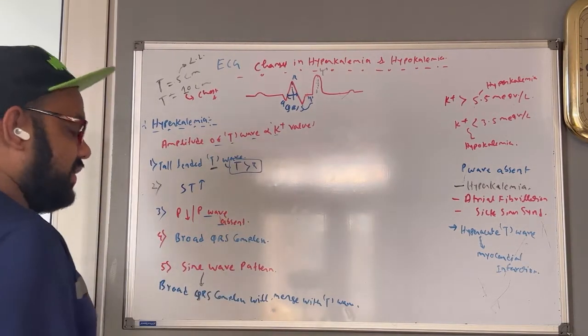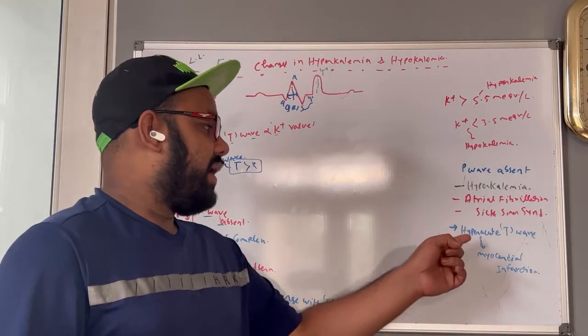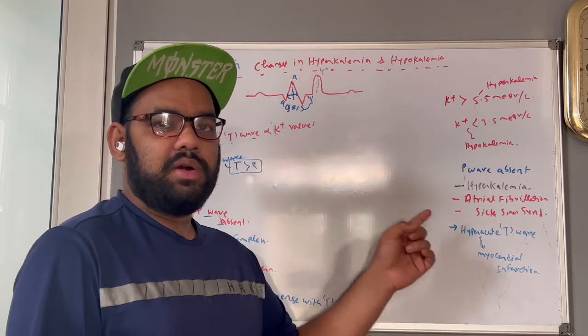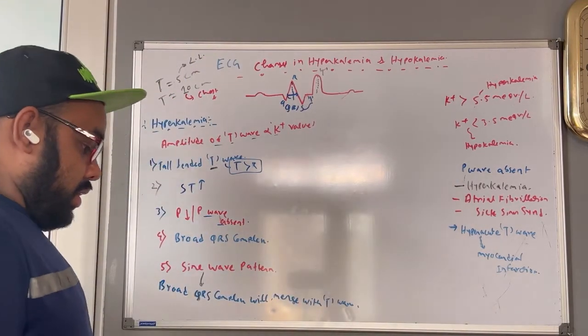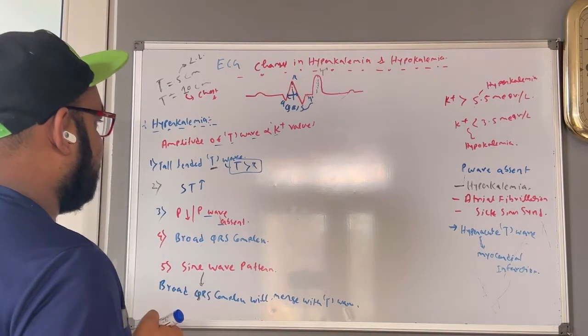And one more thing, as I said before also, if in the exam it is mentioned hyperacute T wave, it means that we have to understand it in terms of myocardial infarction.